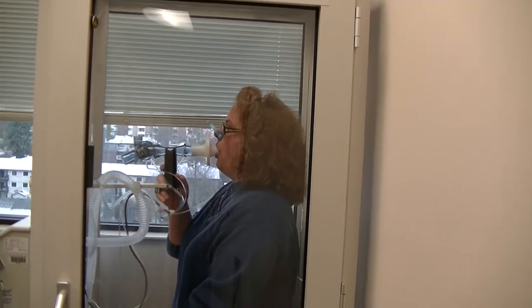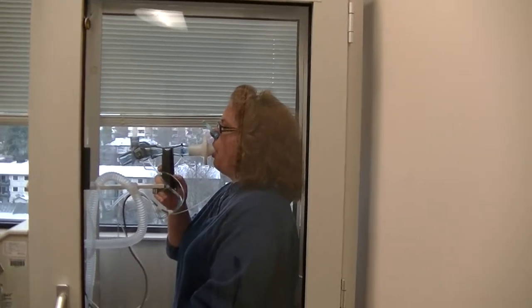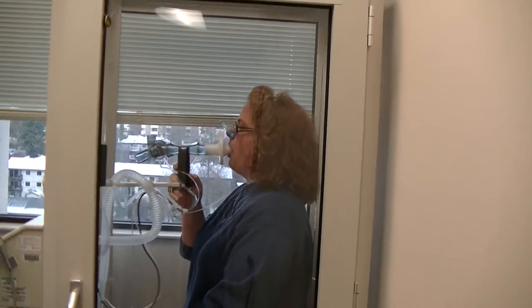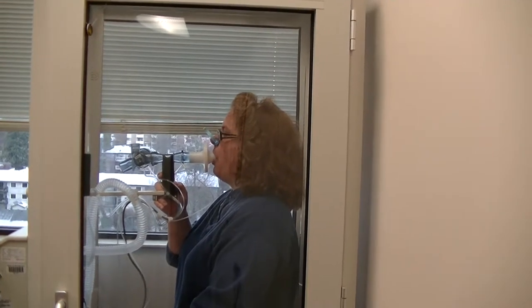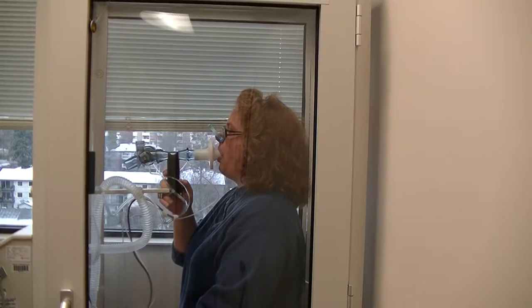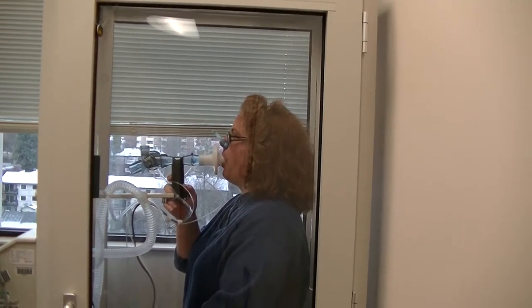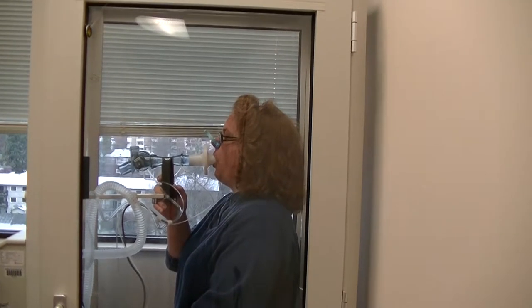Breathe in and out. Perfect, Tara. So do you like Spokane? Oh yeah. Well, it's much milder. I'm used to, at this time of year, negative 30s and 8 and a half feet. That's hard on your lungs too — 10-foot snow drifts. Yeah.